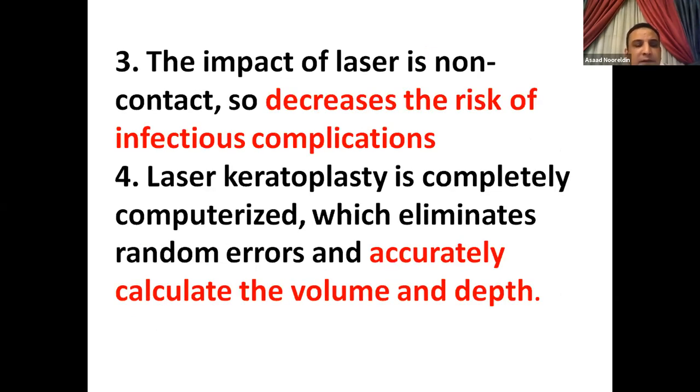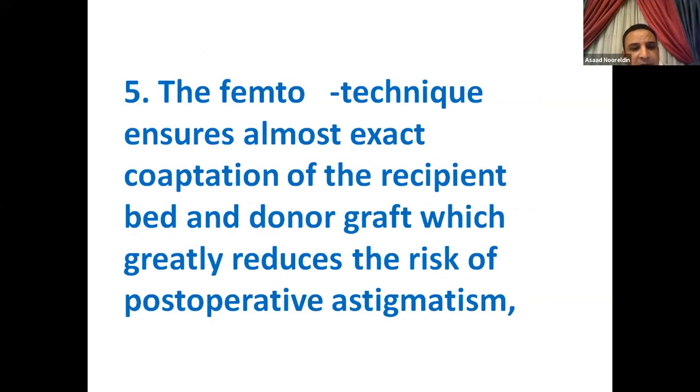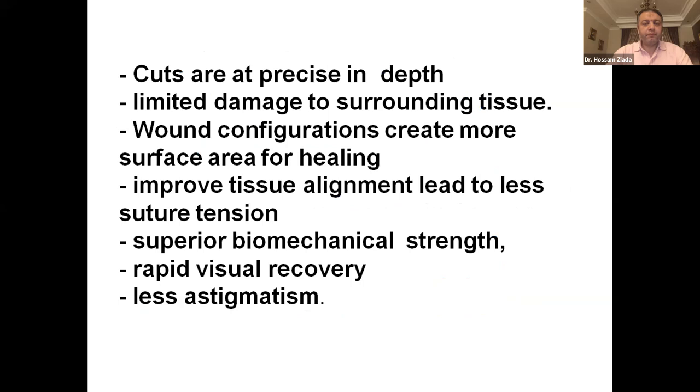With the laser, there is no contact between the patient and the laser system, so it decreases the risk of infectious complications which may be present in the conventional technique. Laser keratoplasty is completely computerized, which eliminates random errors and leads to accurate calculation of volume and depth in a precise pattern. The femto technique ensures almost exact coaptation of the recipient bed and the donor graft, which greatly reduces the risk of postoperative astigmatism. In brief, the cuts are precise in depth, with limited damage to surrounding structures and tissue.